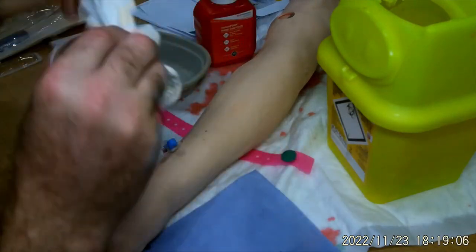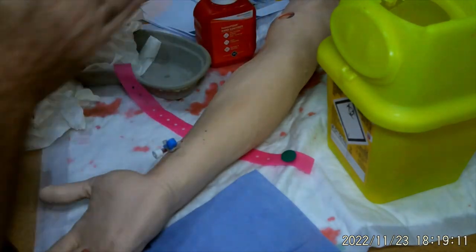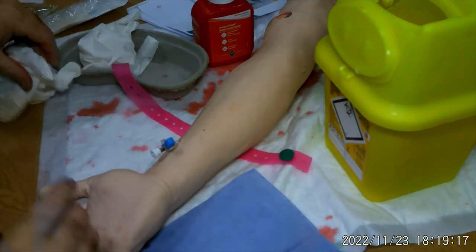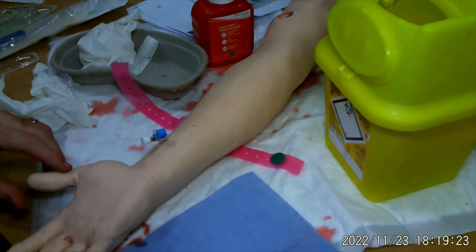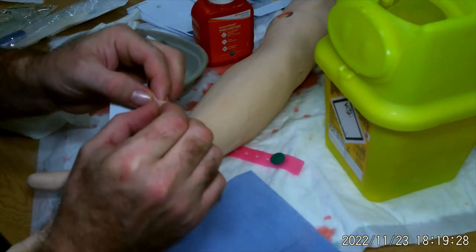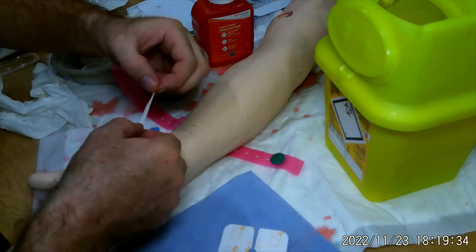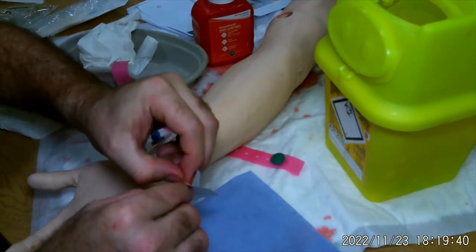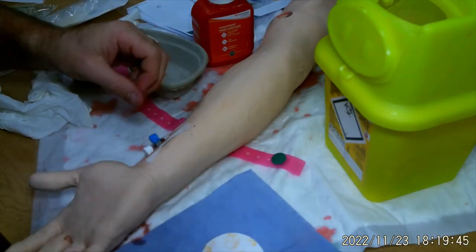Now I've done that, I can mop up and clean any mess. My gloves come off and this goes into domestic waste. I could now clean my hands again. If I'm happy that this is nice and clean, I'm now going to put my fixator on. With this particular fixator, it's got two strips which will hold the wings down — just close that port off. These always go parallel to the cannula and we don't cross them so that we can still see where the cannula has entered into the vein.